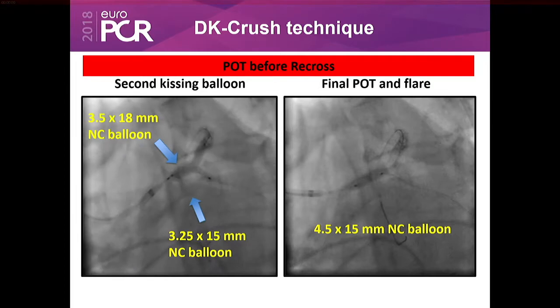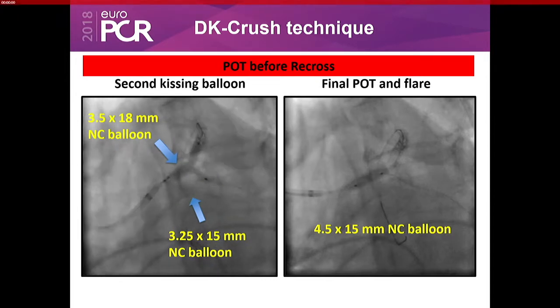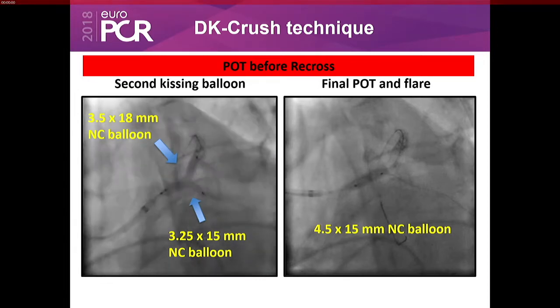We don't prefer TAP unless you have an angle more than 70 degrees. Because in this case, you don't have much metal inside the left main. On the contrary, the crushed stents are actually beyond the left main stent. When you go for TAP in this acute angle, you will have a new flow divider inside the left main stent. So we actually prefer the DK crush.